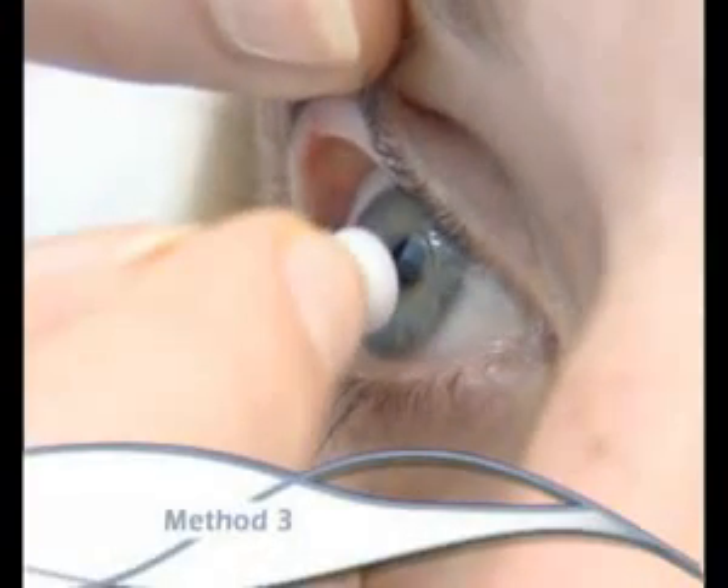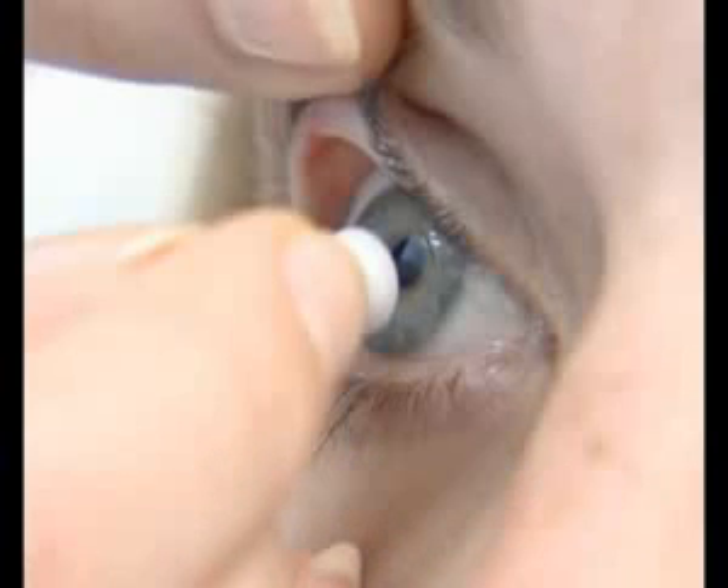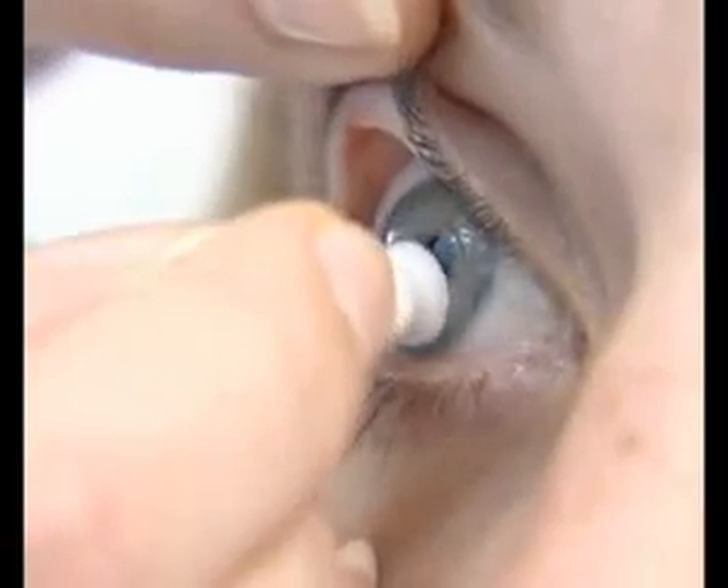With your eyes wide open, lift the upper eyelid at the lashes and with a suction pad held between the thumb and index fingers, create a gentle suction on the lens itself, not on the eye.